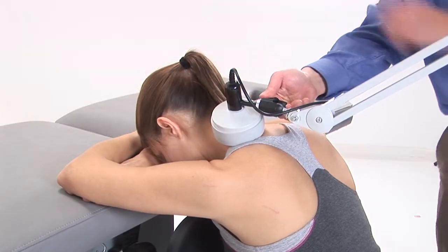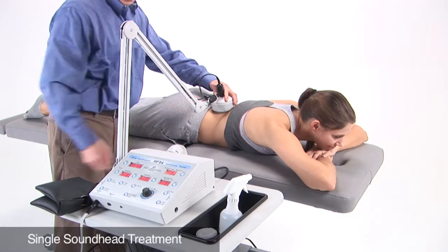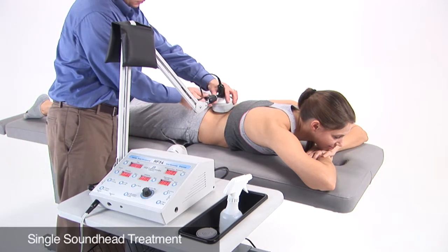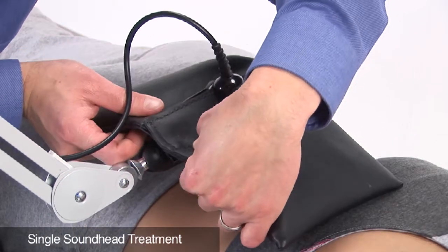The transducer can be positioned safely in a hands-free manner because it is pulsed at a 50 percent ratio and cannot create standing waves inside the body. Setup for the HF54 is designed for speed and accuracy. Turn on the unit using the power switch and position the sound head on the desired area of your patient. The weight bag is used to improve contact with your patient and can be placed on either the ultrasound arm or attached directly around the sound head.